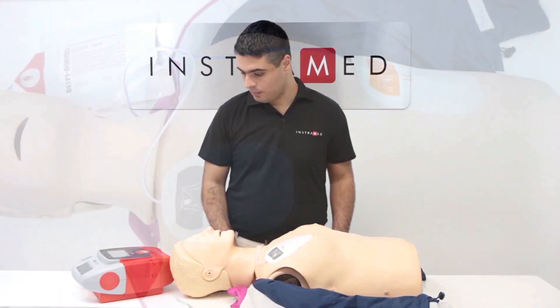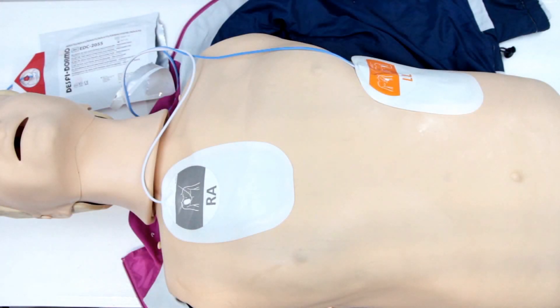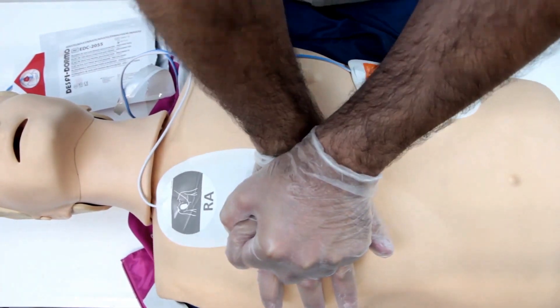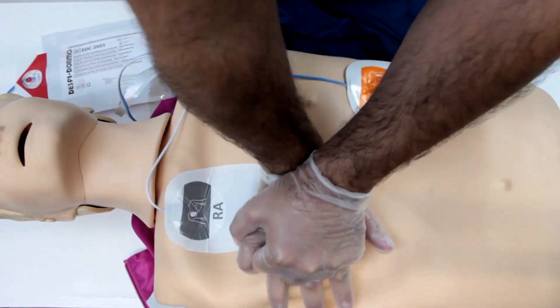Check to see if any involuntary movement has occurred during the period of analysis. If so, begin the process once again. If not, administer CPR, Cardiopulmonary Resuscitation.